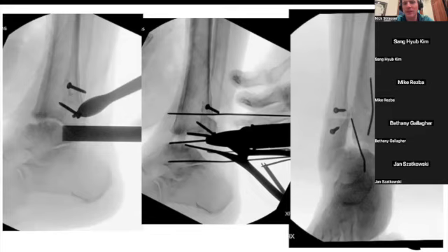Outside of that, it's a lot of osteotomes, curettes, and rongeurs to clean it out. I think having things like small saws can be helpful as well. I do use a pituitary and curettes and that kind of stuff. I'd be curious, Jan, do you have the, what do they call it, the power osteotome? Do you have anything like that?